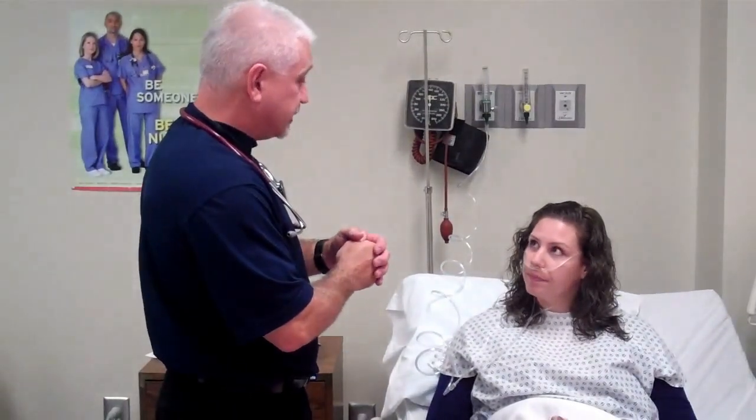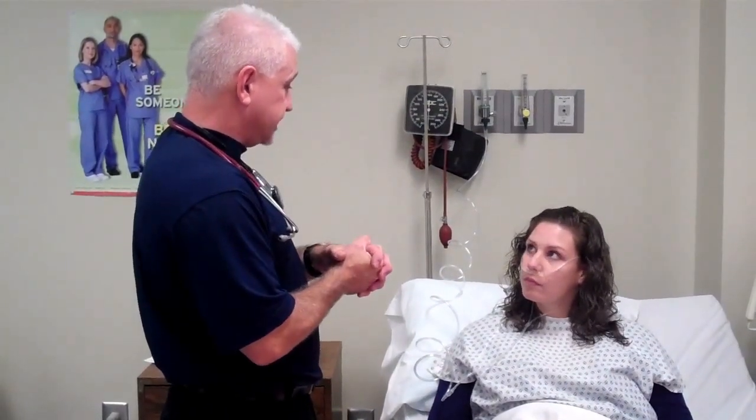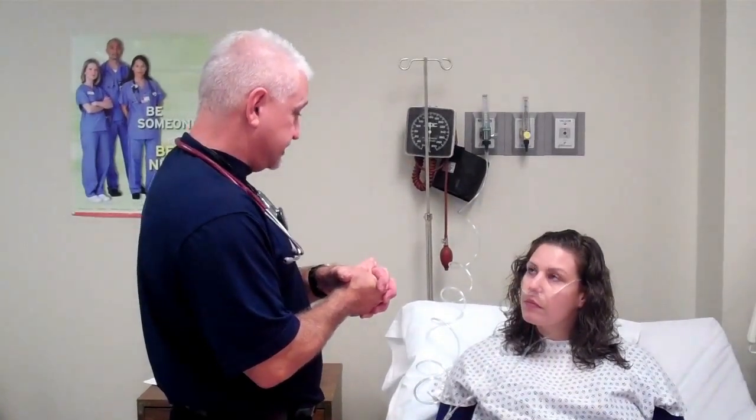Okay. At this point, I'd reassess my patient again, check her heart rate, respiratory rate, sat, color, and level of dyspnea. And if I needed to, I'd make adjustments. If she had no other questions for me, do you have any questions for me? I do not. Okay, we come back and we check every 8 hours. I'll check on you again. If you need me, just call your nurse.